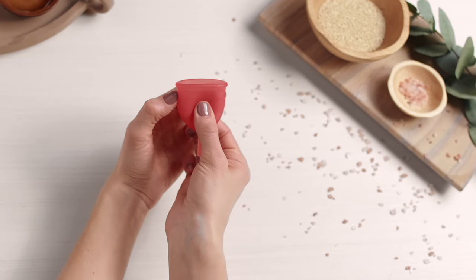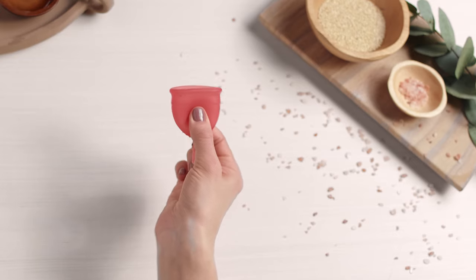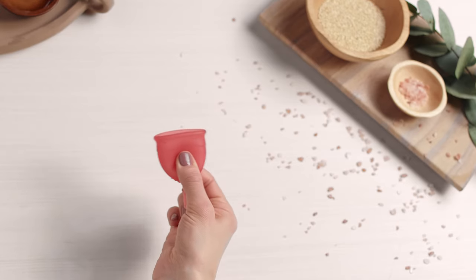First, pinch the base of the cup to release the seal, and then wiggle the cup from side to side as you gently remove it.